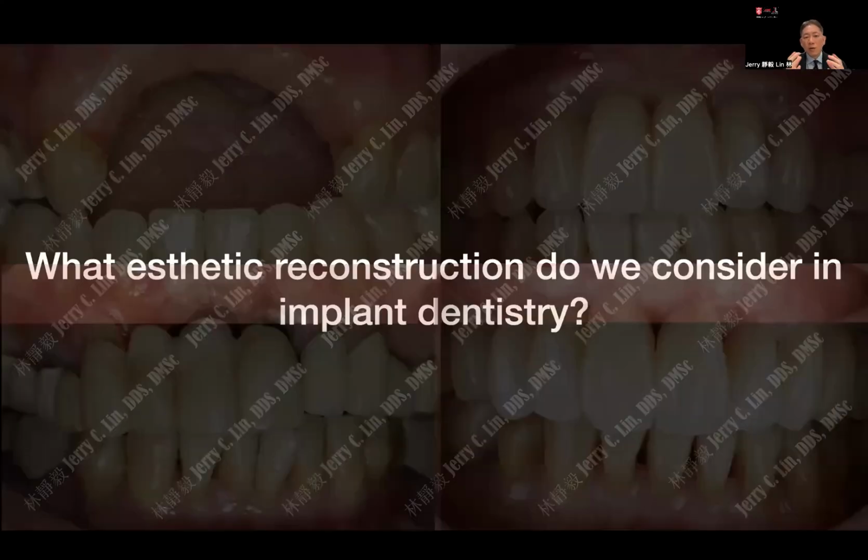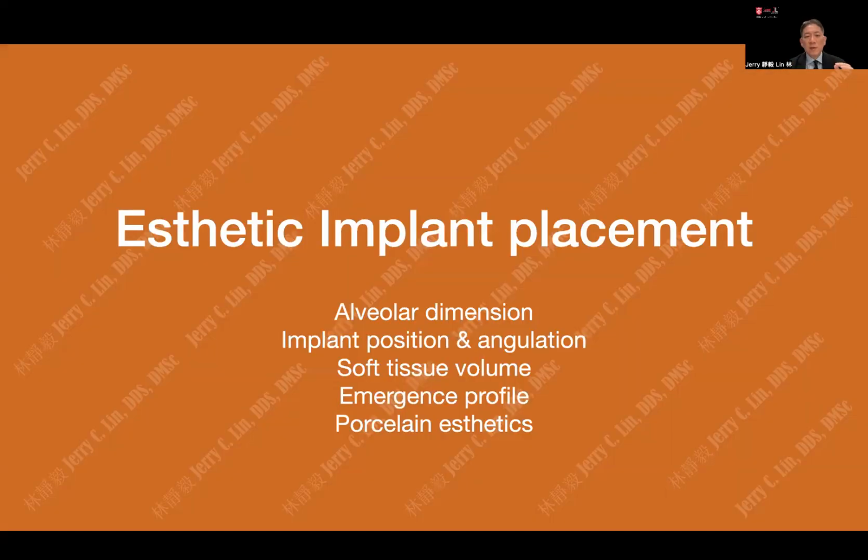So what aesthetic reconstruction do we consider in implant dentistry? That's a question we always have. And then we want to think about what the key elements for aesthetics are. So for aesthetic implant placement, there are a few elements I would like to talk about before we head to the cases and the clinical work.